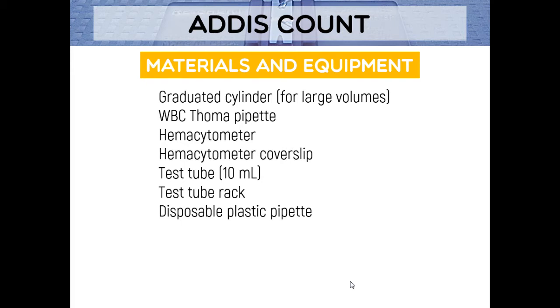Because again, your WBC Thoma pipette has a bigger bore, na siya mas dakong buslot, compared to the RBC Thoma pipette. So therefore, it would facilitate the easier aspiration of the larger elements, especially mga casts or epithelial cells, di ba? So at least ma-appeal gud sila if we use the WBC Thoma pipette kay mas dako yang bore kaysa the RBC Thoma pipette. Okay. All right.